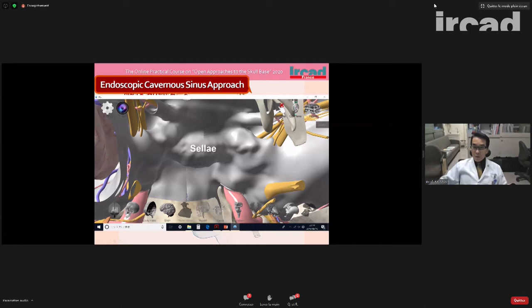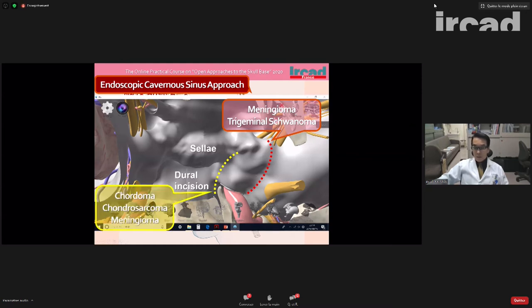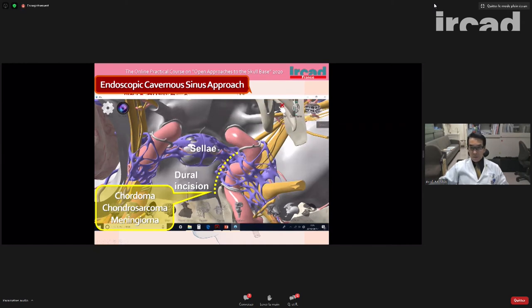So when we go into the cavernous sinus, the dural incision is here like this, or inside. The lateral incision is mainly for meningioma and trigeminal schwannoma, and the medial incision is for chordoma and chondrosarcoma. So in this case, we use the medial incision like this. And we first go into the cavernous sinus from inside. Usually the cranial nerve is located lateral to the cavernous sinus, so we can directly see the cranial nerve at the end of the resection.